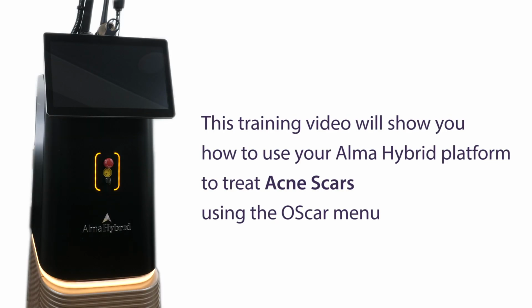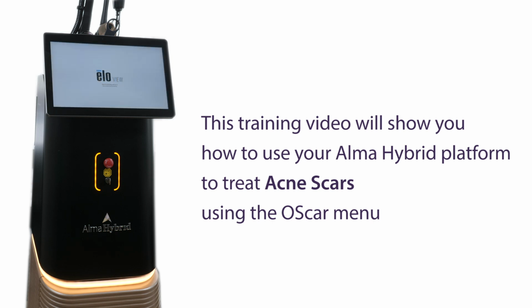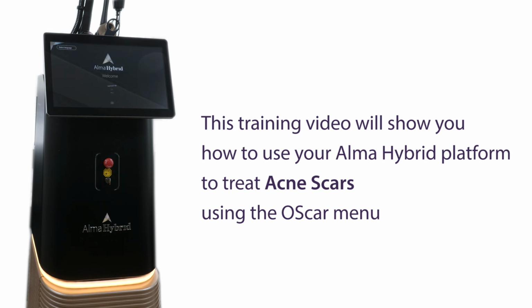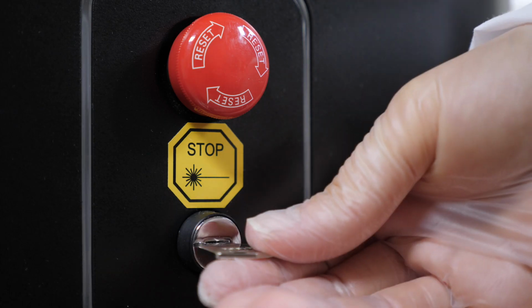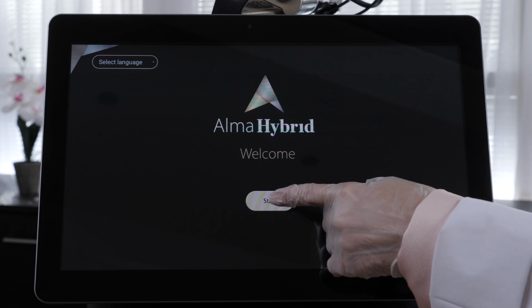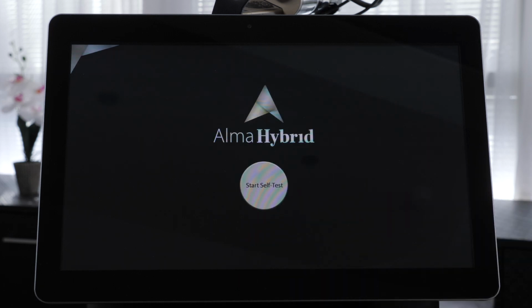This training video will show you how to use your Alma hybrid platform to treat acne scars using the Oscar menu. Turn the key clockwise. Tap the Start button. Press Start Self-Test.